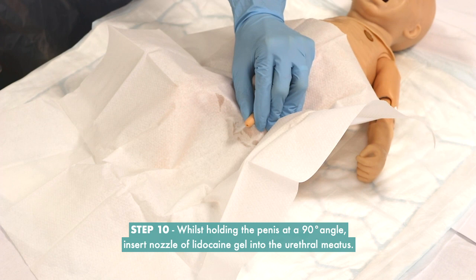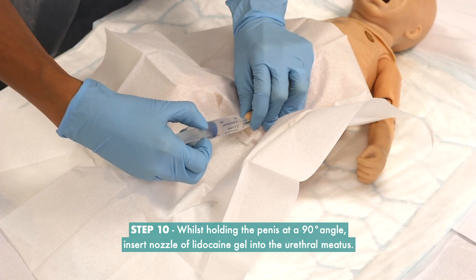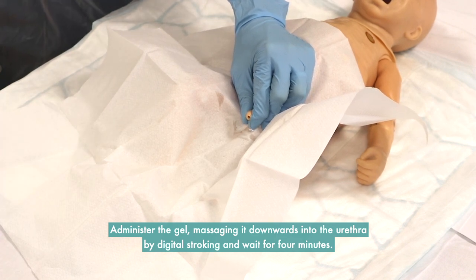Step 10: Whilst holding the penis at a 90-degree angle, insert the nozzle of the lidocaine gel into the urethral meatus. Administer the gel, massaging it downwards into the urethra by digital stroking, and wait for 4 minutes.